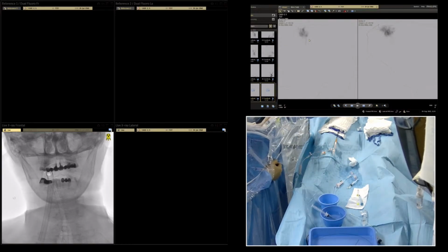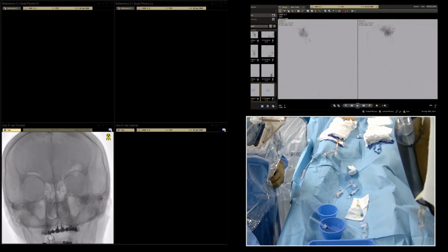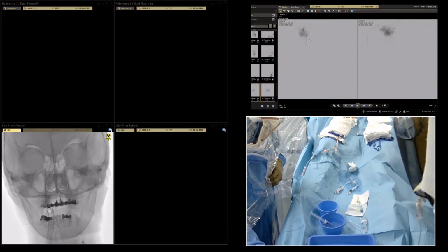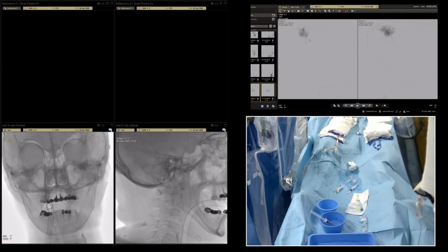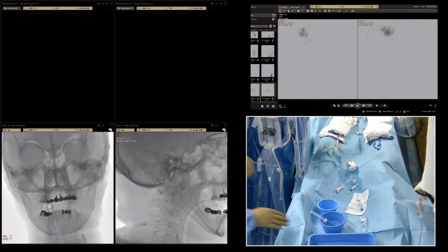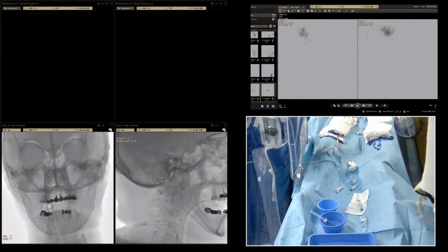Option number 2, we can place Leo Plus and coils, but then it's a little bit risky. Which option is better? Derivo is better. Yeah? Okay, let's place Derivo. Headway 27.